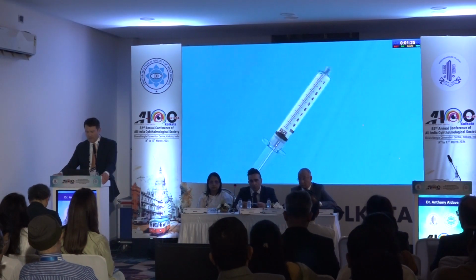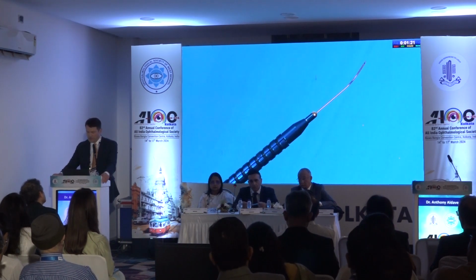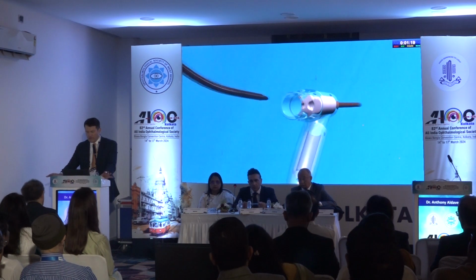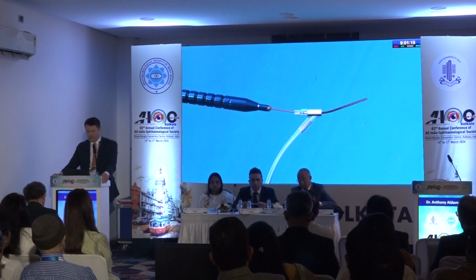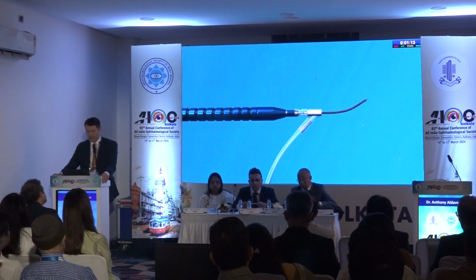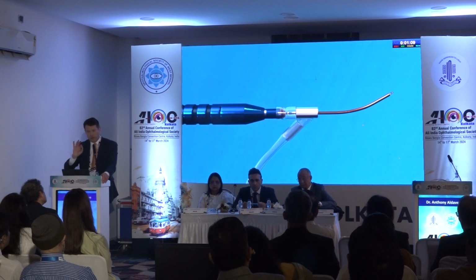So this is an animated video from CorneaGen. I have no financial interest, but I do consult for CorneaGen. What this technique uses are these irrigating forceps. So it's your forceps very similar to what you would use for DSAEK surgery, microforceps, but with this irrigating sleeve that's coaxial.